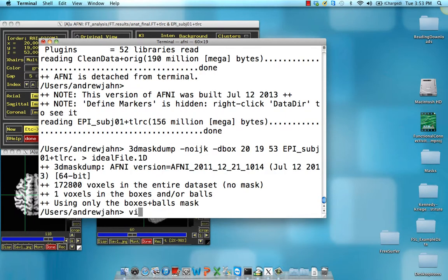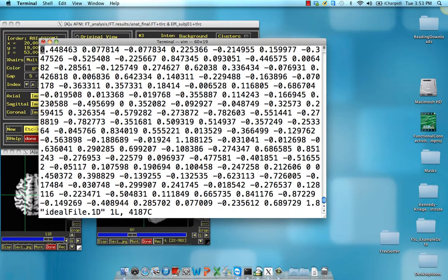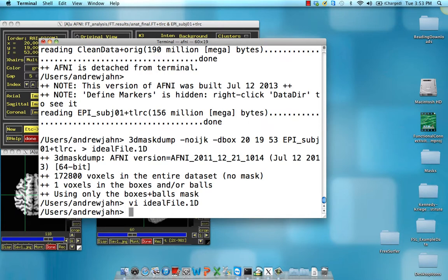So there it goes. And notice the first thing about this ideal file is that it's just in one row. For our functional connectivity analysis to work, we need to do 1D transpose to make it one column.